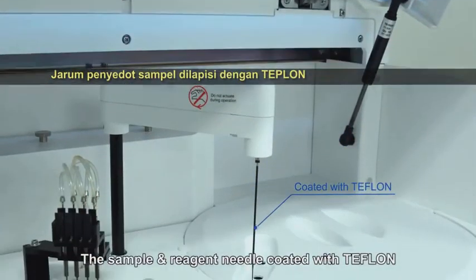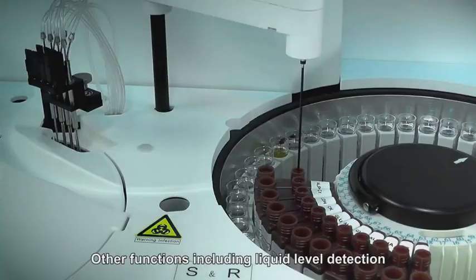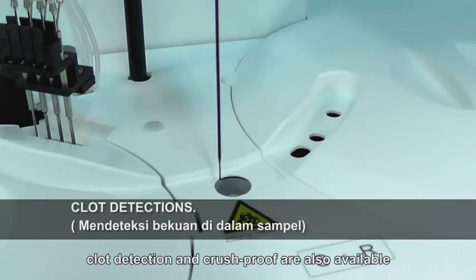The sample and reagent probe, coated with Teflon, is washed automatically after each pipetting to avoid cross-contamination. Other functions including liquid level detection, clot detection, and crash-proof are also available.